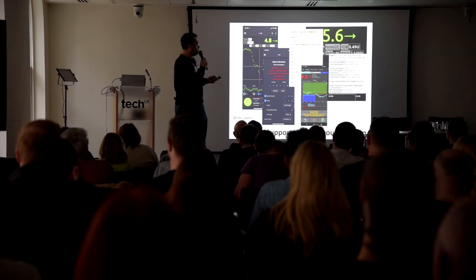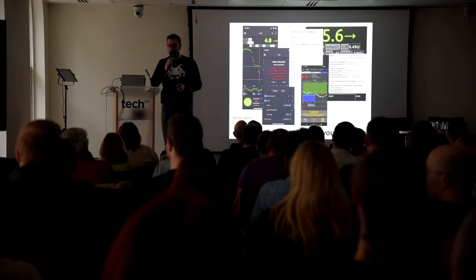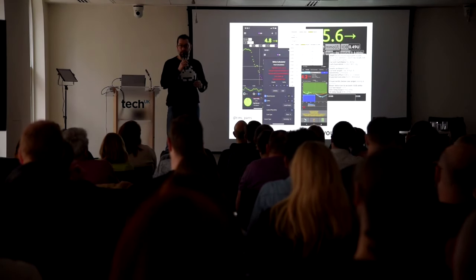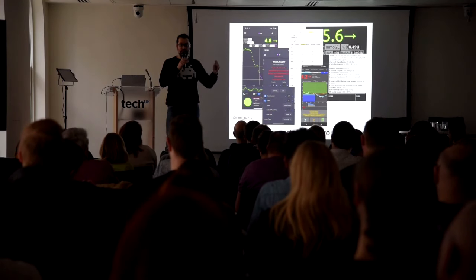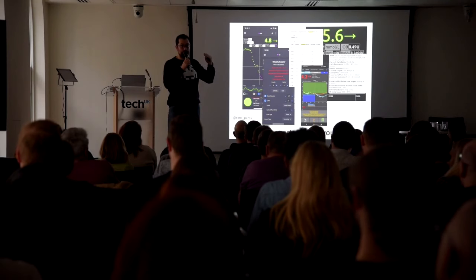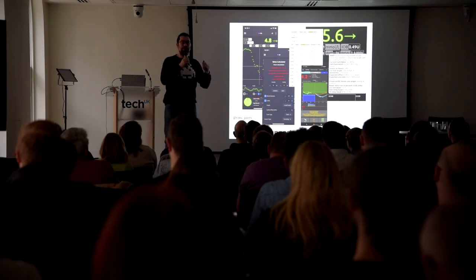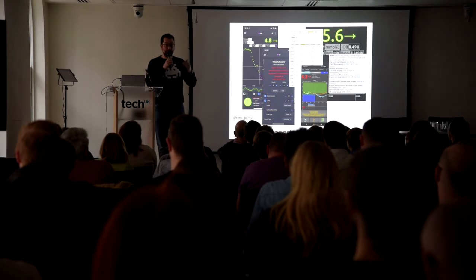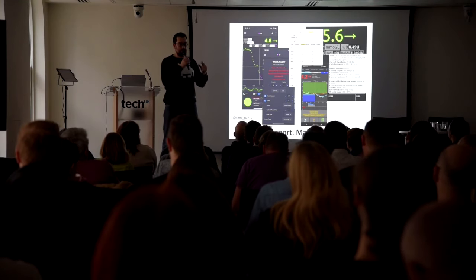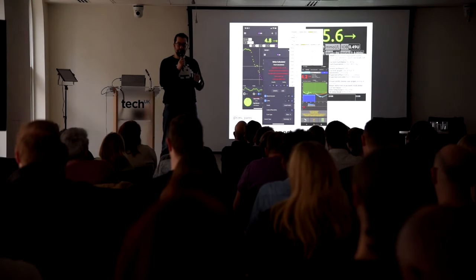And finally, we've got this little box here. This is auto-tune. Now, auto-tune is designed, and it has limitations, we'll put that up to start off with. Auto-tune is designed to take your basal rates and to measure, based on your glucose data and your carbohydrate data, whether your basal rates are right or not. And it does that within a set of limits, and it is limited to people who only have a single carb ratio and sensitivity factor throughout the day.